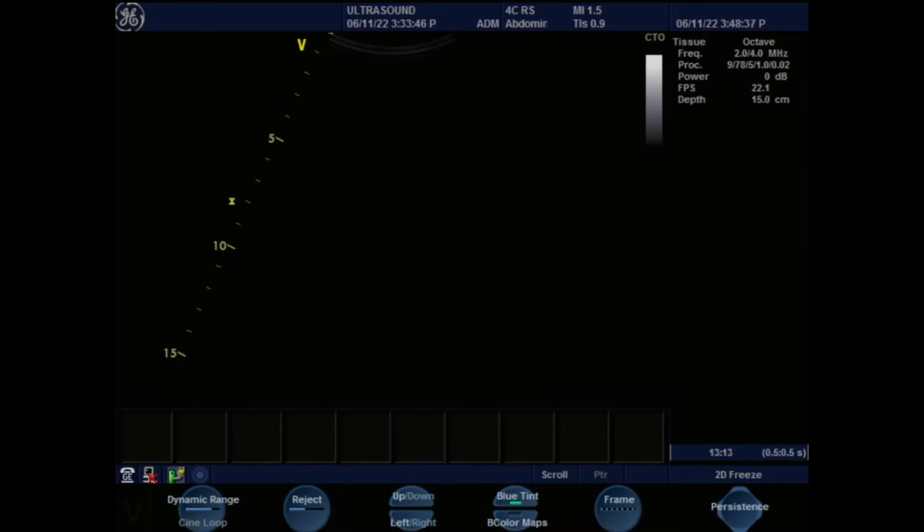All right, so we'll start with the pancreas. So this is my ultrasound probe. This is a curved probe for all of you who use ultrasound. This is the notch here which says patient right. So basically, we're taking a 3D body and putting it on a 2D screen.